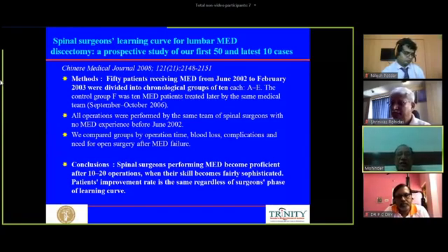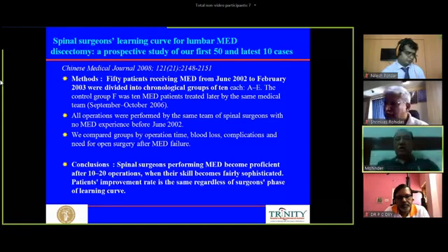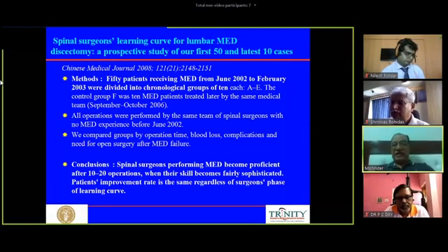That is a time when either you will leave endoscopic spine surgery and switch over to some other technique, or you have to have the patience and perseverance to continue with the procedures. The moment you cross 25 to 30 cases, I think the journey becomes very, very comfortable. But having said that, I again want to share that endoscopic spine practice is not every surgeon's cup of tea. Some surgeons are not cut out to work through narrow confines and through tubular vision, so that handicap is with the surgeon.